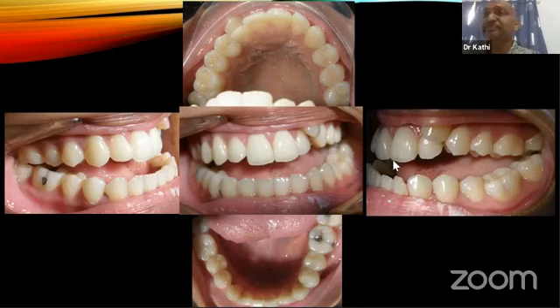Okay, another patient. This patient, sagittally, he looks okay, but he hardly shows any incisors. See his intraoral, he has a huge overjet, very deep overbite. From the cephalometrics, it was deemed he had a skeletal deep overbite. So this one, luckily he agreed for surgery. So we are in the midst of preparing him for the surgery.